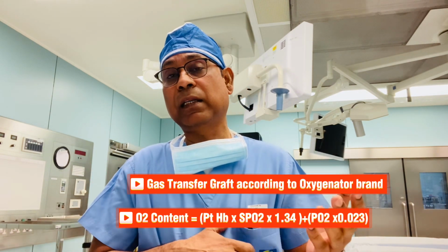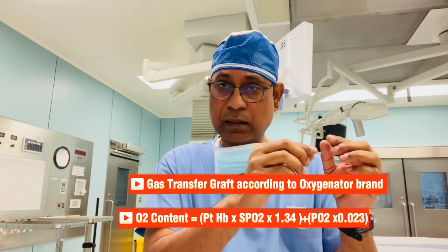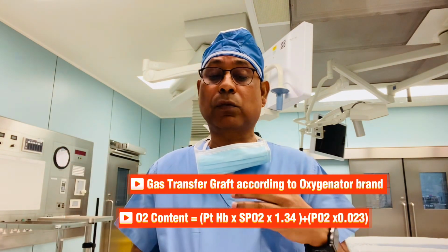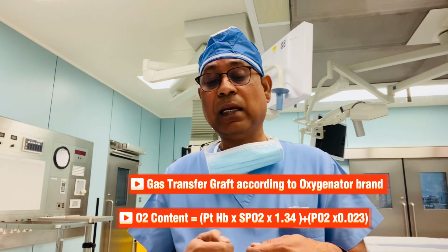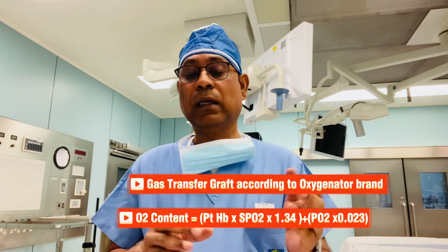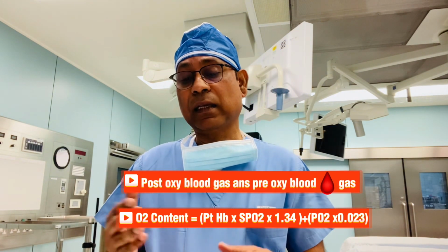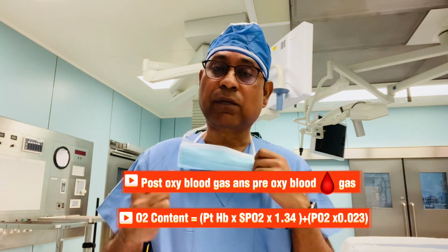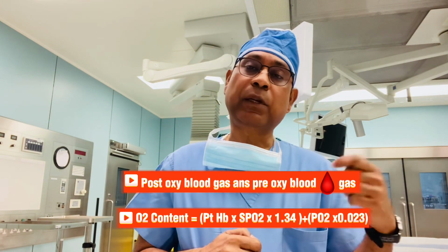For the post-oxy content, you take the blood gas from the post-oxy and get the hemoglobin, the saturation, the constant 1.34, plus the PO2 times the constant 0.023. So we get the values with the help of the post-oxy arterial blood gas and the pre-oxy blood gas.